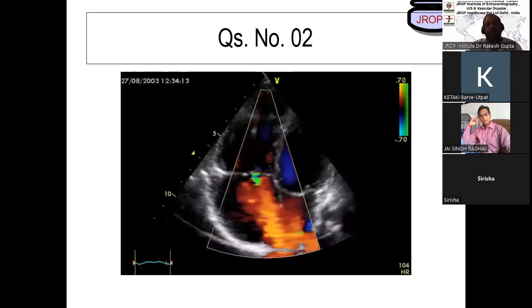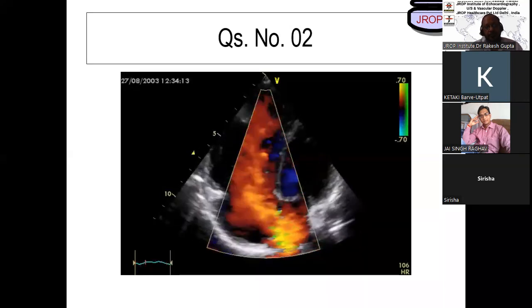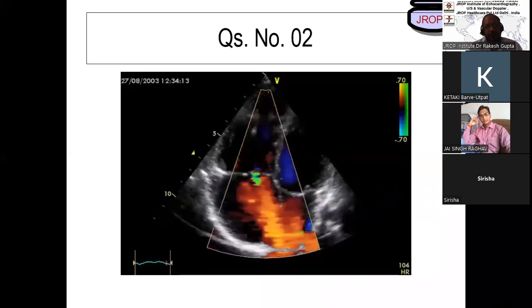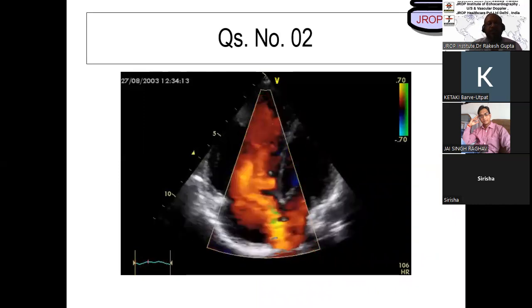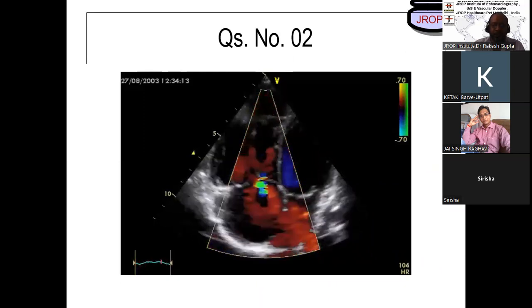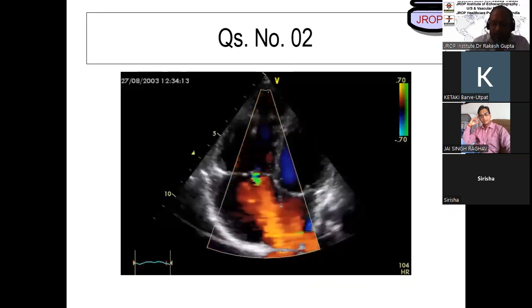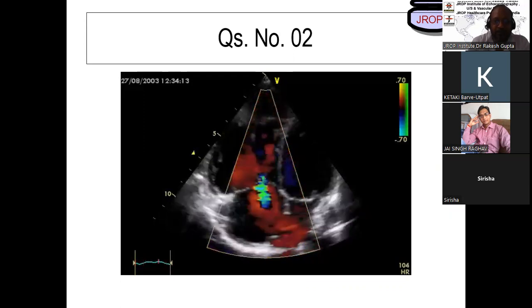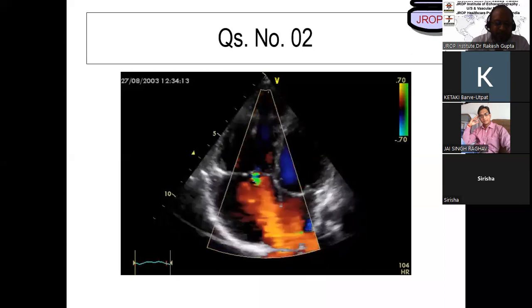You would like to improve your statement? Tricuspid regurgitation, if PA pressures are increased, the tricuspid regurgitation velocity is high. Then PA pressures are elevated, and then you have an underestimation of TR velocity. Great, you get an additional 1.5, 5 out of 4. Thank you, sir.